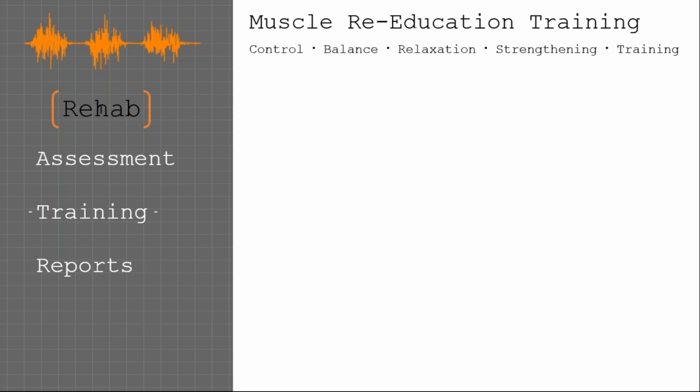So there's a lot of different ways we can take a look at what's going on from the musculoskeletal perspective. Obviously, there's strengthening. When we think about muscles, we think about how strong am I, how much can I lift, how much can I move, what's my contraction look like, is my contraction healthy? So there's a strengthening component, and then there's a training component, which starts to mesh all those things. We have these things called templates, which we'll show shortly, and we'll get into it.